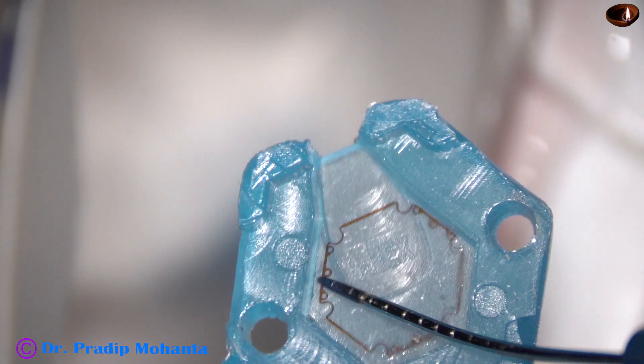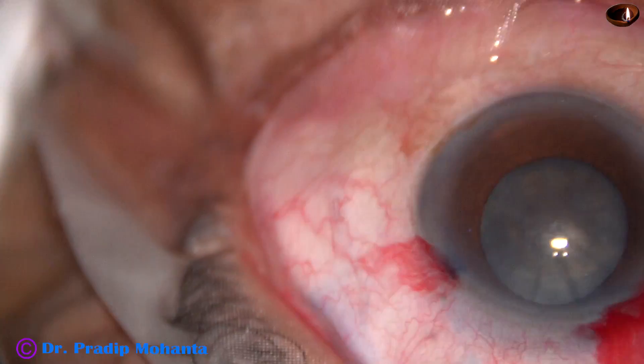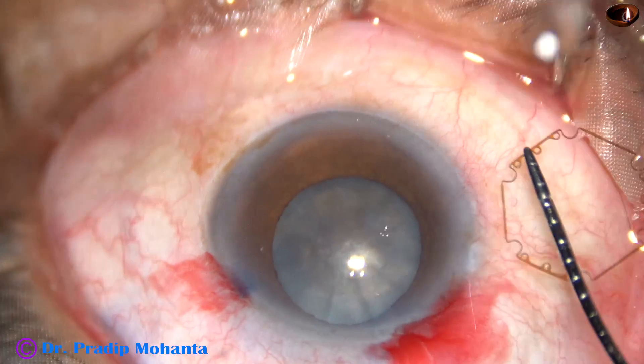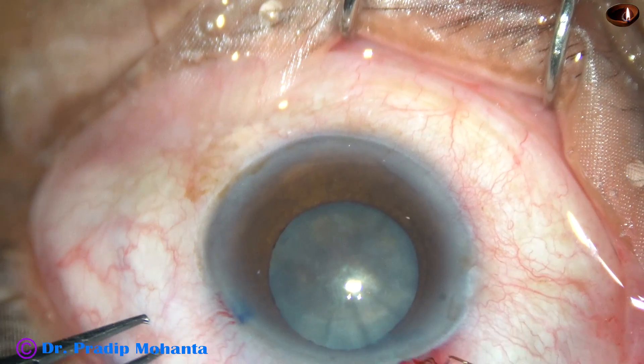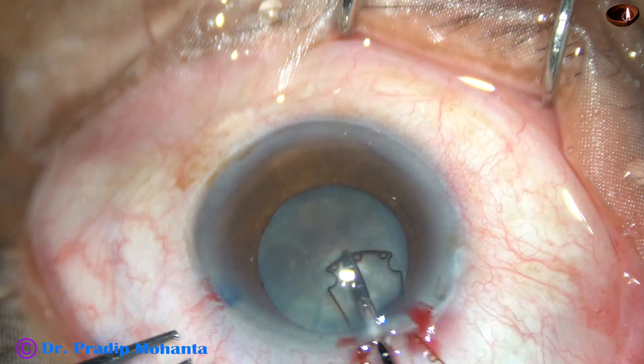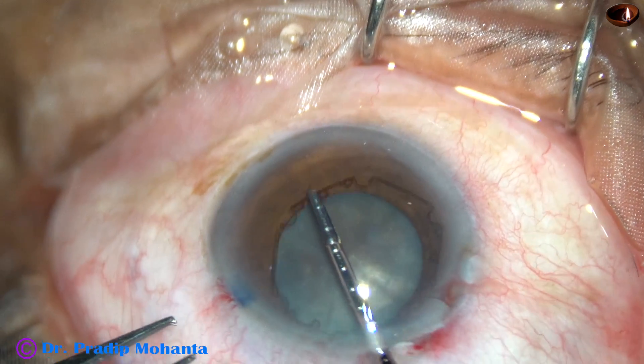The chamber has been underfilled. Some visco has been injected behind the iris. And now I am going to apply this hexagonal pupil expansion device. It has been invented by Dr. Suvin Bhattacharji of Kolkata, India.